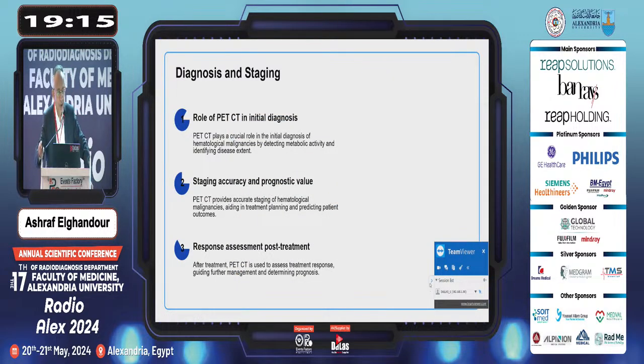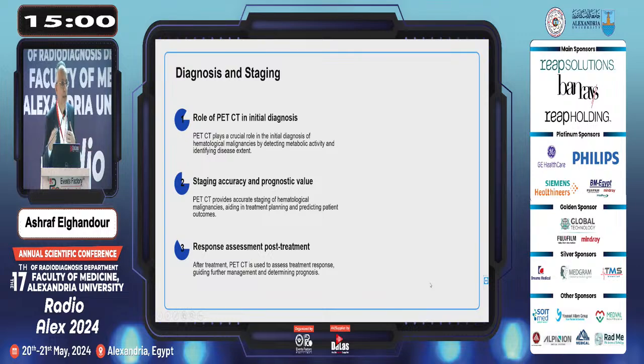Okay. For response assessment and post-treatment, that's what I'm asking. I'm a clinician, so why do I need such PET-CT? Actually, I am a fan of PET-CT. It's maybe 15 years ago or more. The first PET-CT was in an international clinical center, I think in Swiss in Cairo. I went there to learn about PET-CT.